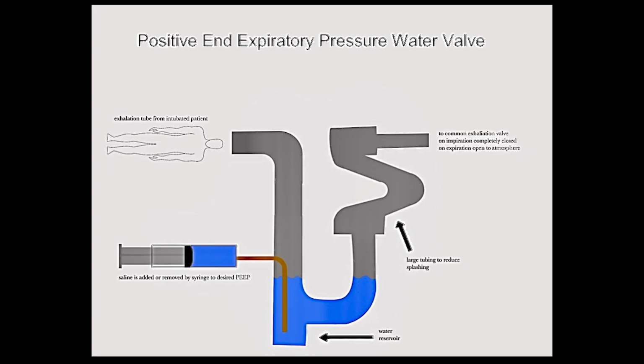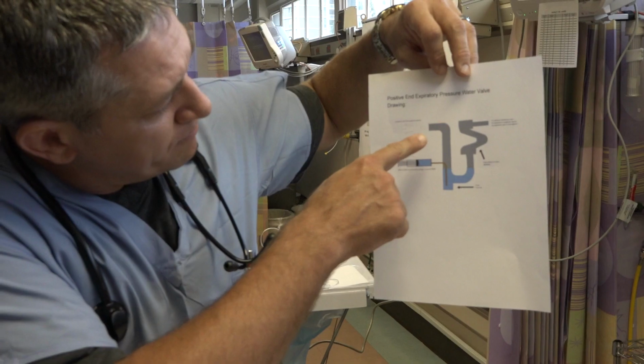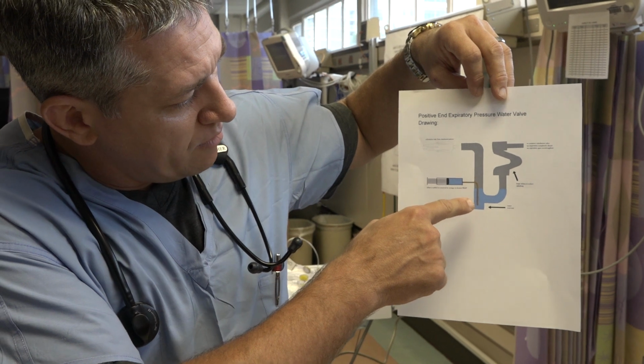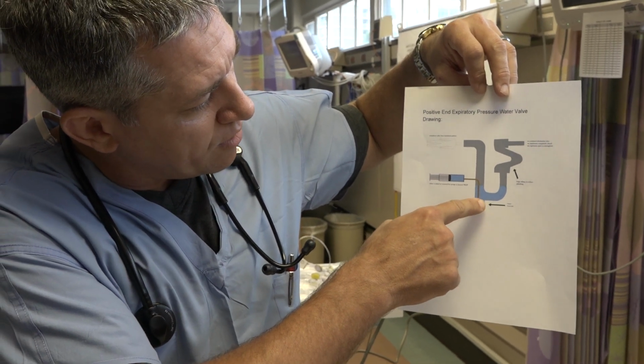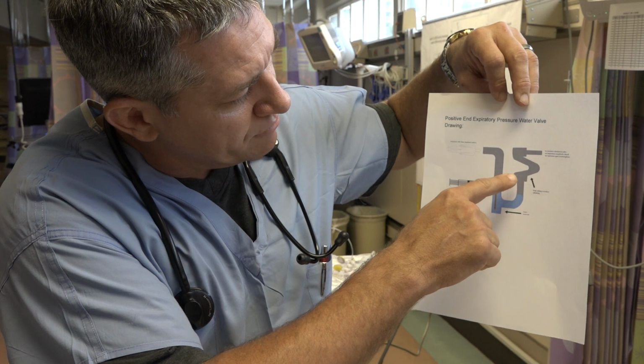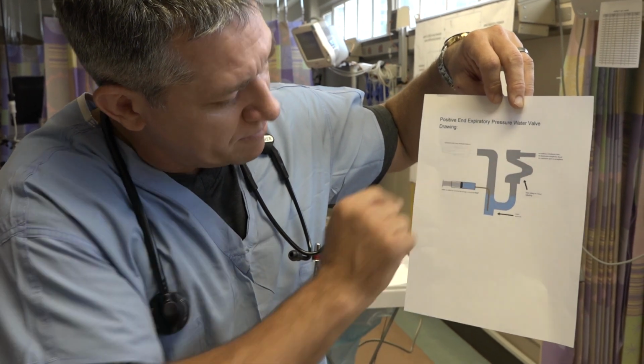The other thing too is we've introduced what's called a PEEP water valve. In this diagram, what you see here is the proximal limb going down, and you'll see a syringe which can add water directly into a water reservoir. As you add more water, you can then increase each individual patient's PEEP. You'll notice also there's some larger tubing which is put there to reduce splashing going up.